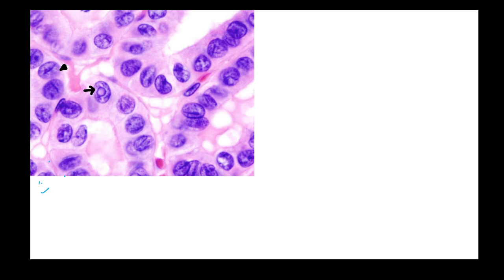So here you can see these are the two cells. First I am marking this one. This cell I am marking as number 1. What are we seeing here, can you tell me? Can you see the nucleus? How is the nucleus? You can notice one thing, that there is a nuclear grooving. Can you see the parallel to the blue line which I had made? This is called nuclear grooving.